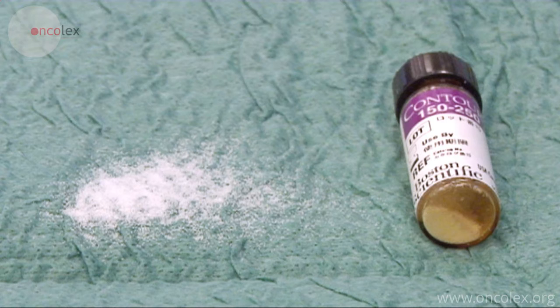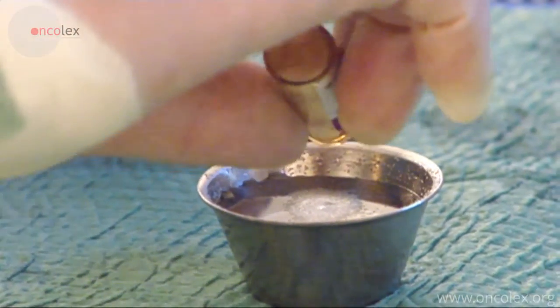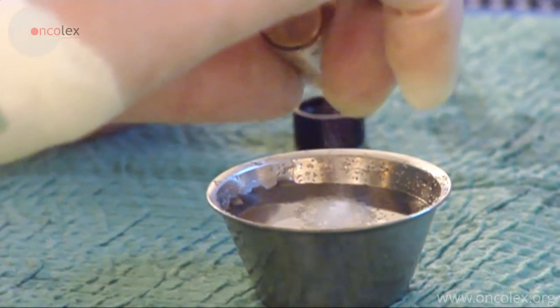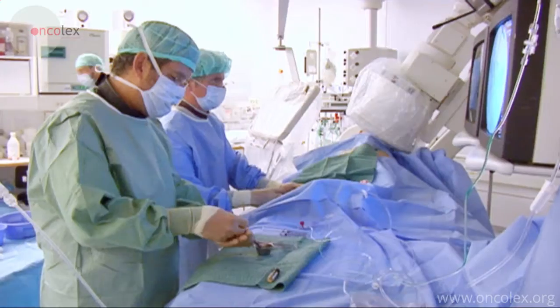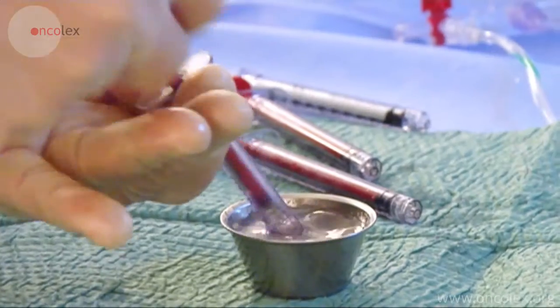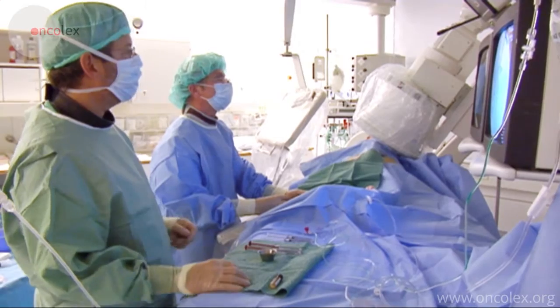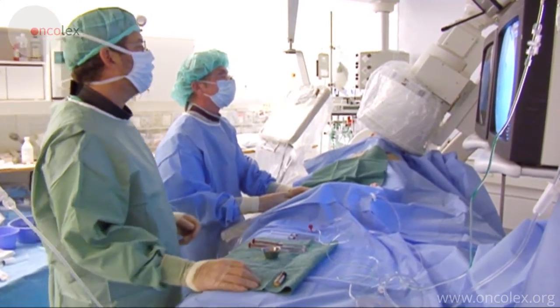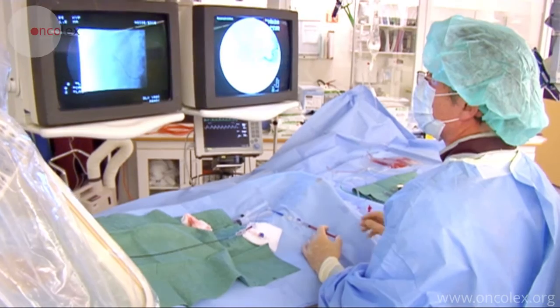150 to 250 micron polyvinyl alcohol particles are used. These are mixed in contrast fluid before injection. The particles are injected guided by fluoroscopy.